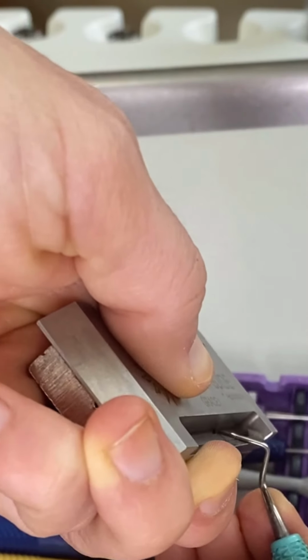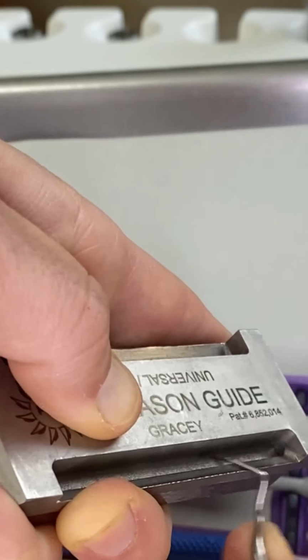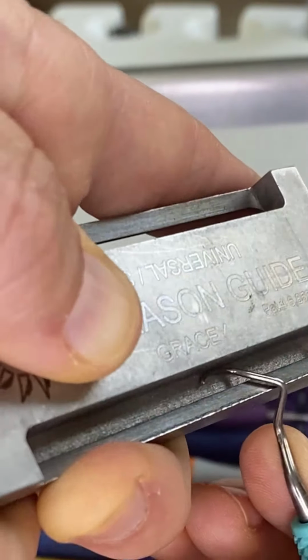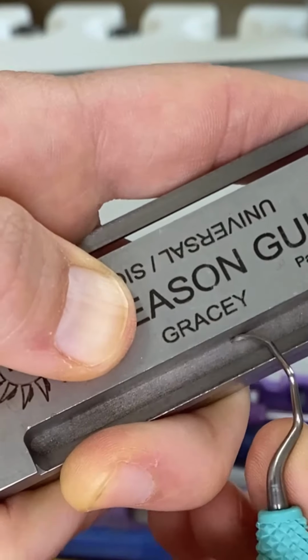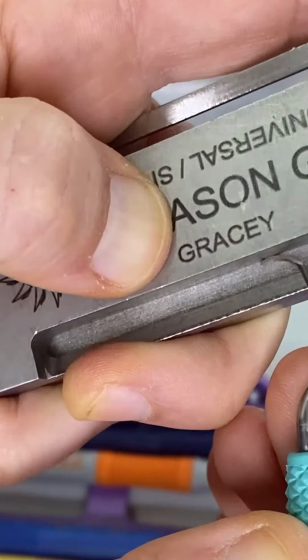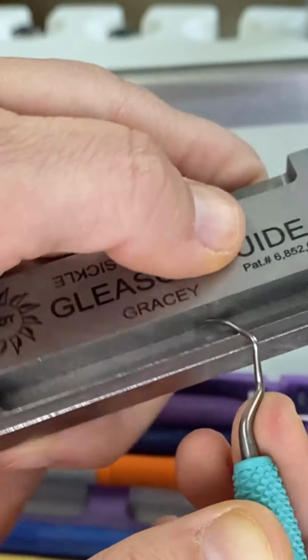So same thing: ramp, wall, stone. And again, if you're too far this way, you're going to get the wrong part of the cutting edge. And if you're too far this way, you'll get the wrong part of the cutting edge. See how I'm just right there against the back of it? Slow. And like I said, eventually.